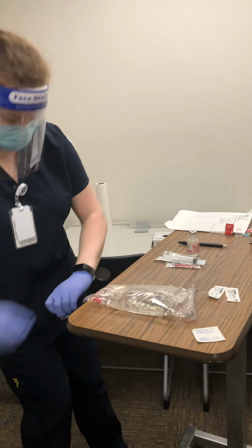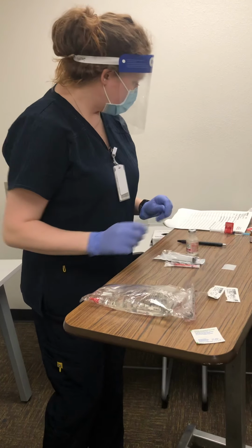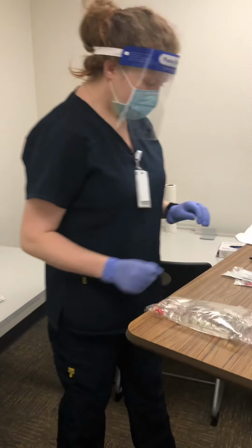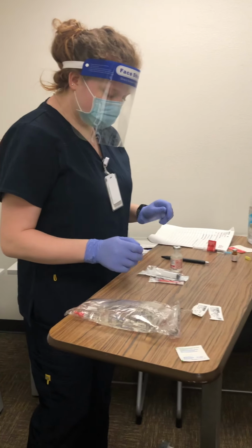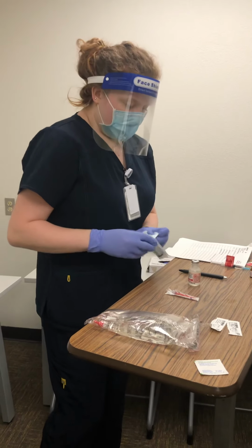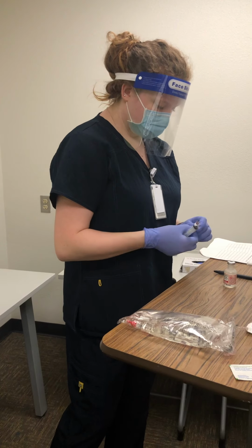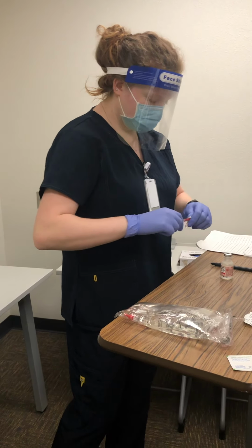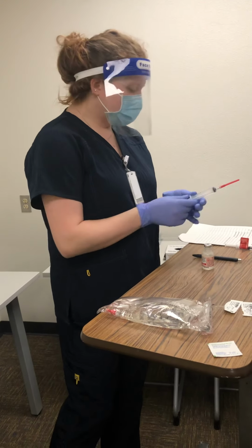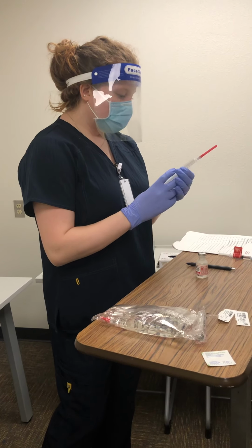So now I am trying to make sure I don't overrun my time. Alright, so that's going to dry for 30 seconds. And while that dries, I'm going to get this ready. Okay. So again, 10 mLs of potassium. I'm going to withdraw that much air.